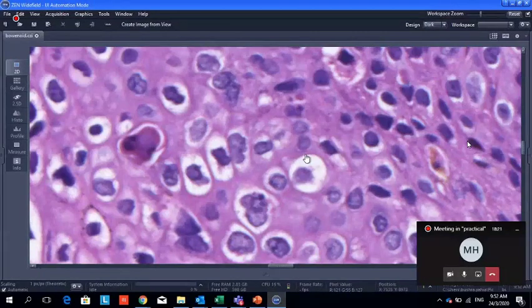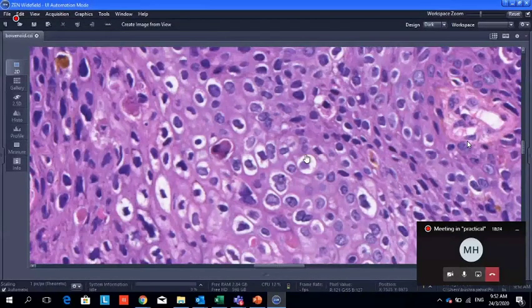Okay, so this lesion we call bowenoid papulosis. It is Bowen disease. Bowen disease is caused by human papilloma virus. Do you know the pathogenesis? Yes, doctor, you told us. Okay, the pathogenesis is the same as cervical cancer, cervical intraepithelial neoplasia. Yeah, same.